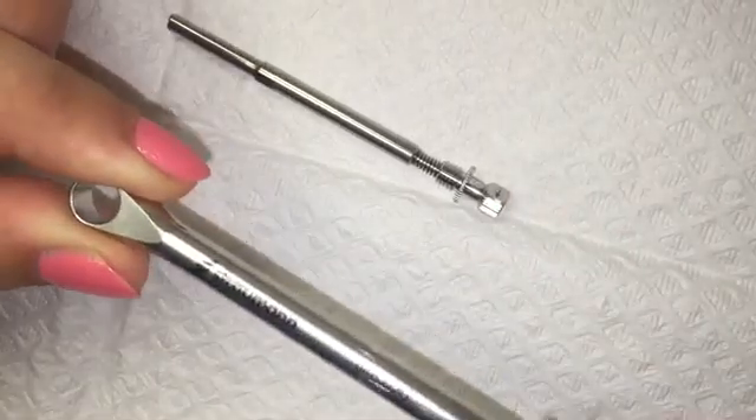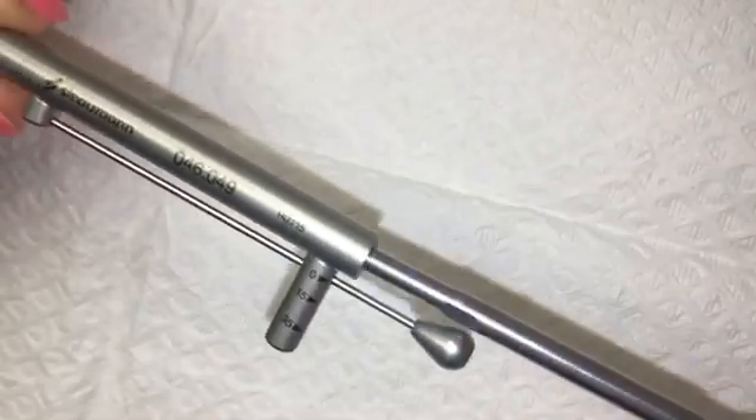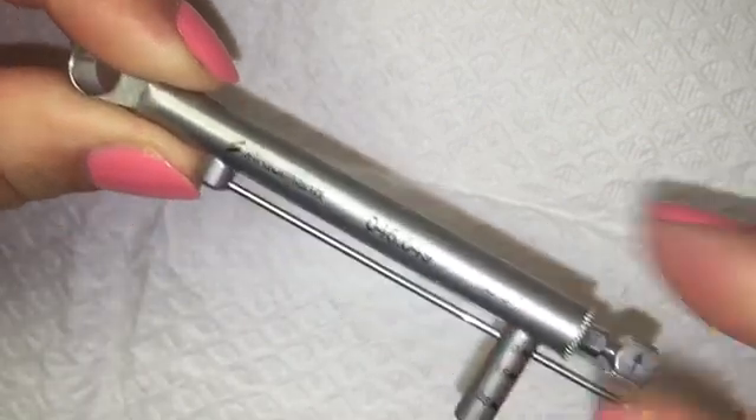Slide ratchet body through torque control device. The flared part of the ratchet must be flush with the fluted end of the torque control device. Insert internal bolt into the opposite end of the torque control device and finger tighten together.